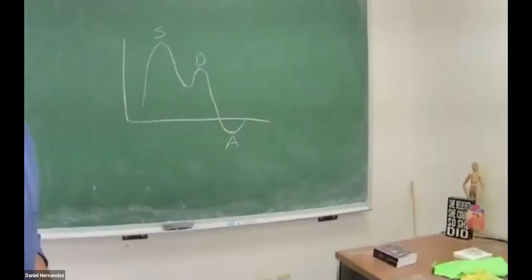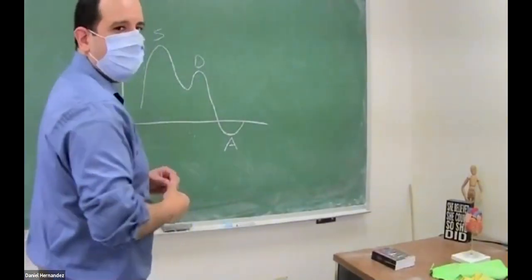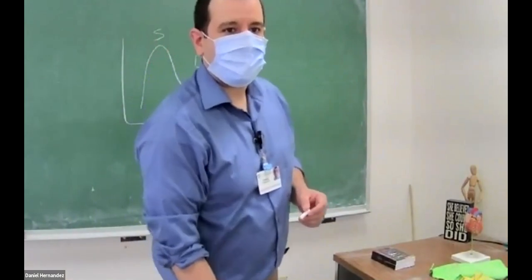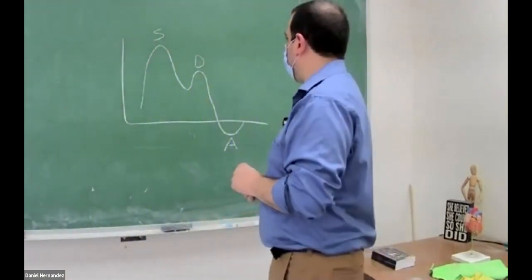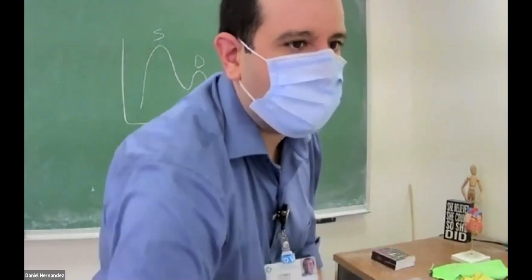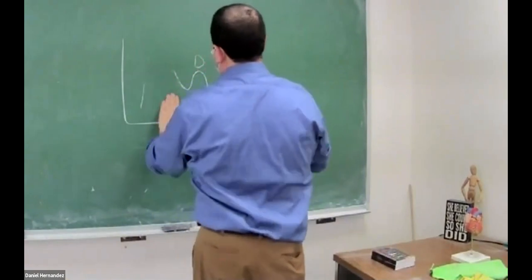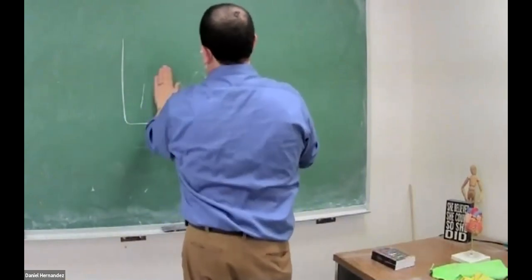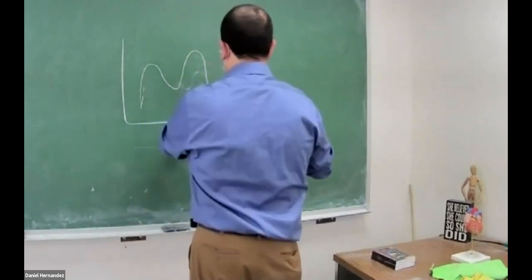It's kind of your pulmonary vein waveform. Oh, sorry, I gave this guy disease. We'll make the S wave smaller than the D wave.